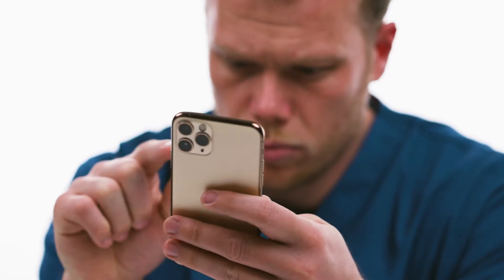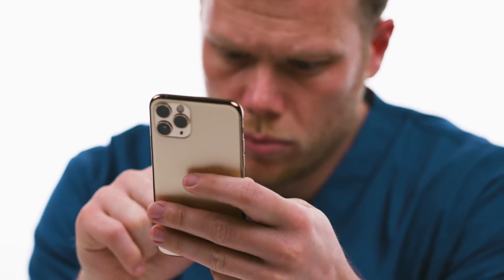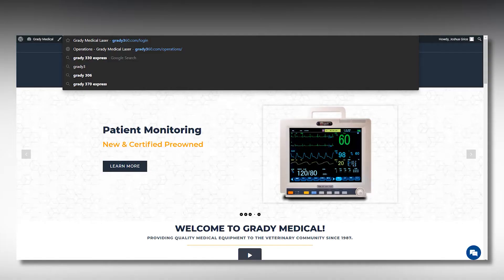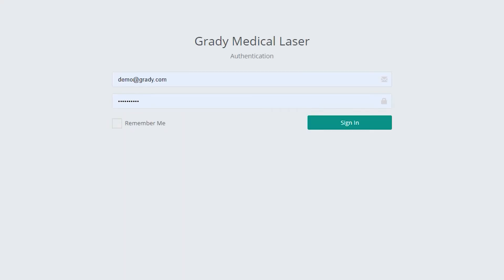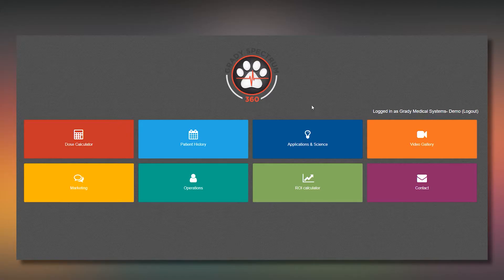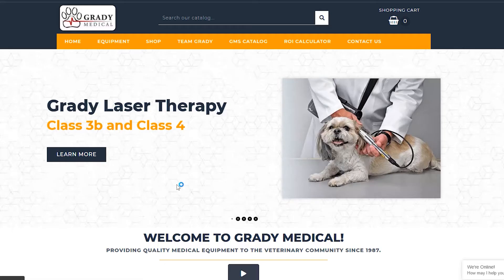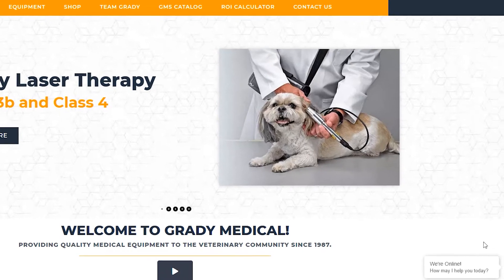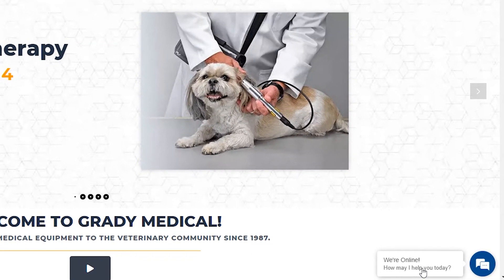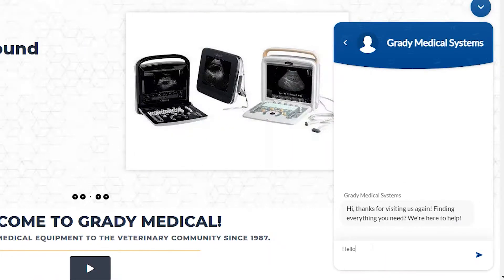Let's dive in and show you how to use it. Go to grady360.com and log in using your username and password. Chat with us online at gradymedical.com if you need help locating your info.